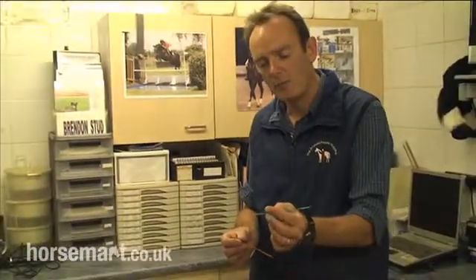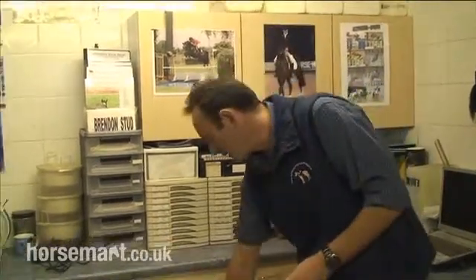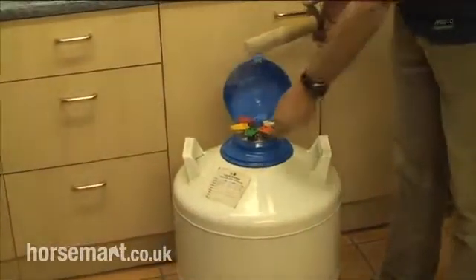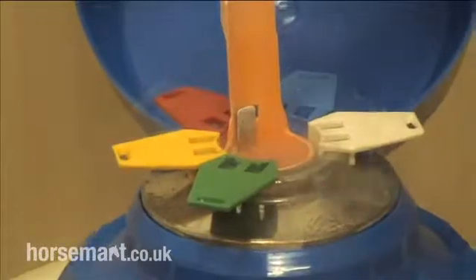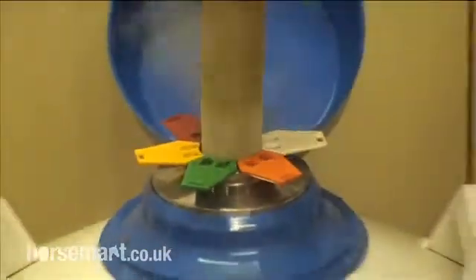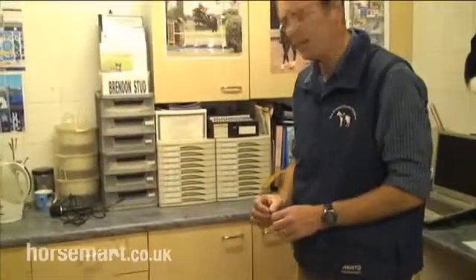Basically we could use one straw per insemination for some stallions, or it might be up to 10 or 12 straws per insemination for other stallions. It gets stored in a canister like this — this is a frozen semen dewar. The straws are immersed in minus 196 degrees C liquid nitrogen and they can be stored there pretty much indefinitely. We've certainly used semen from stallions that have been deceased for 10 or more years and found the semen to be perfect, as it was the day it was collected.